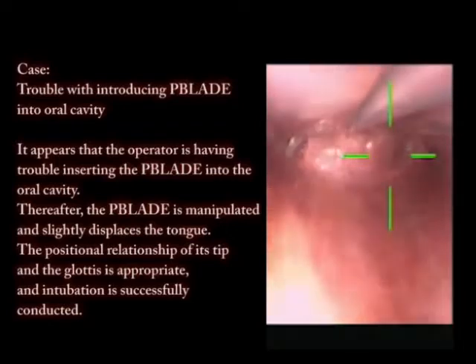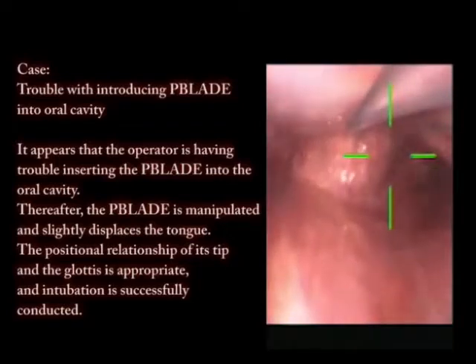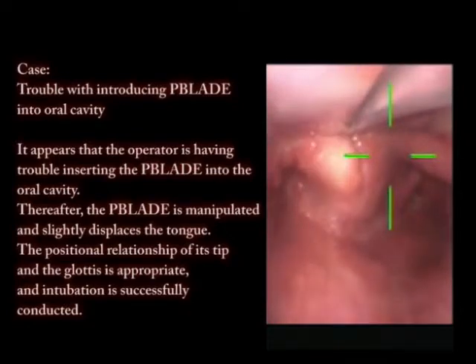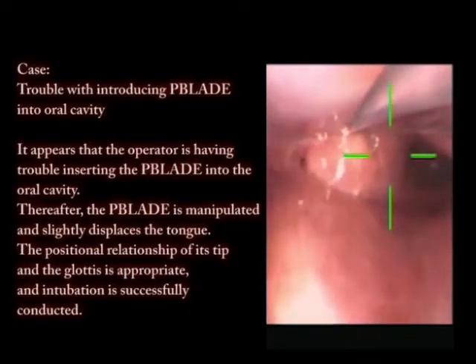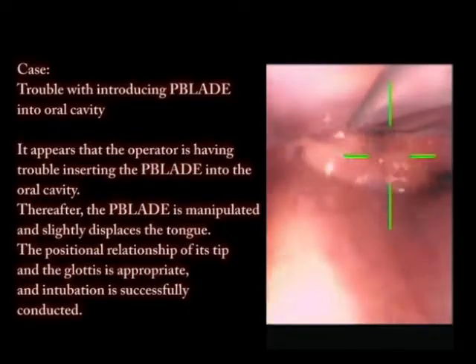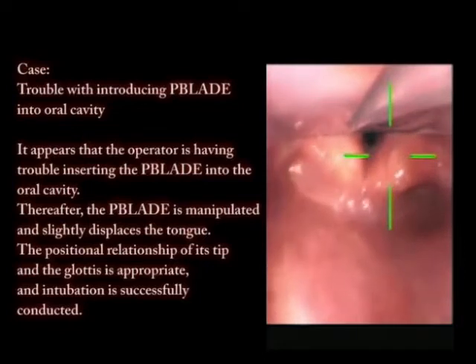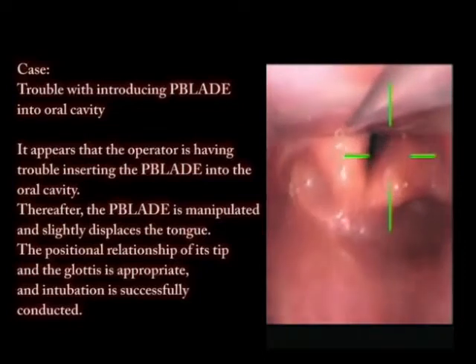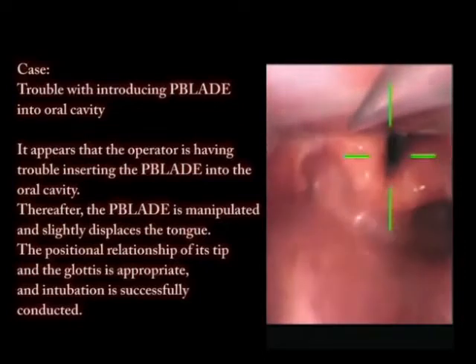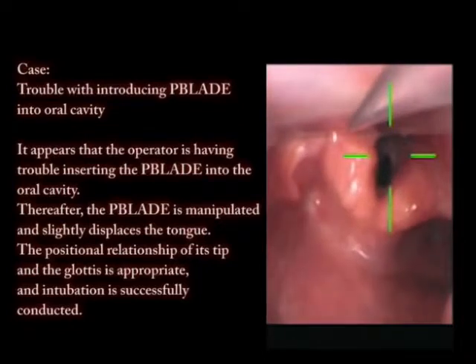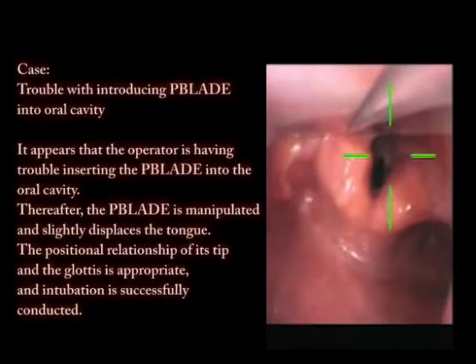Thereafter, the P-blade is manipulated and slightly displaces the tongue. The positional relationship of its tip and the glottis is appropriate, and intubation is successfully conducted.